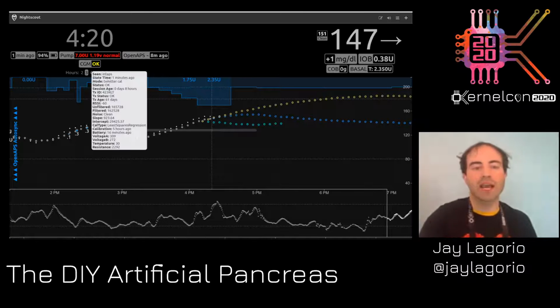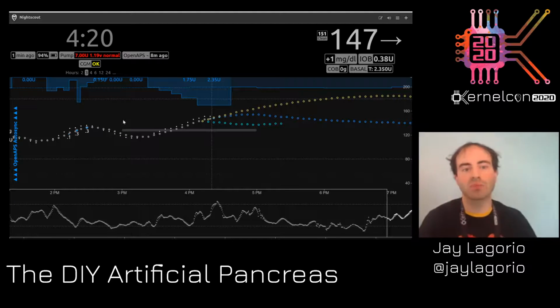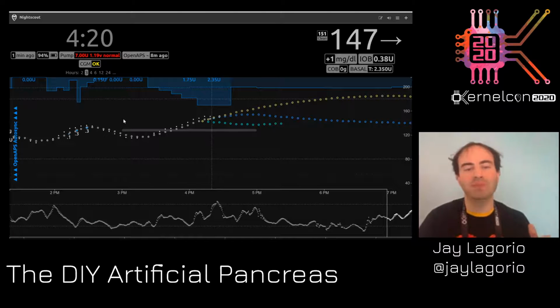You see these gray lines, and it tells you a little bit more as well. I changed this morning. Now you can see this gray line here. Those are what happened in the real world. And then right here, you see this lighter gray. I knew that I was going to talk and my adrenaline was going to try and push my blood sugar down probably. And so what I asked it to do is for the next 2 hours, starting at 3, only really try to get me up to between 120 and 130, instead of the usual 100, which could then result in a low blood sugar event.